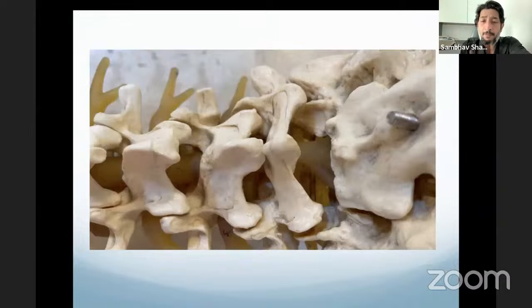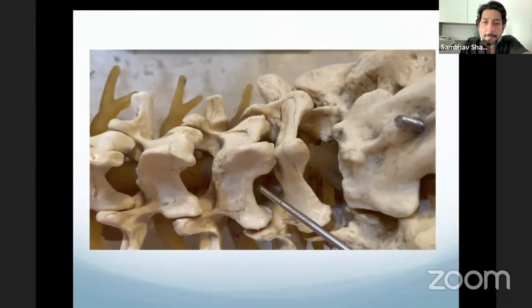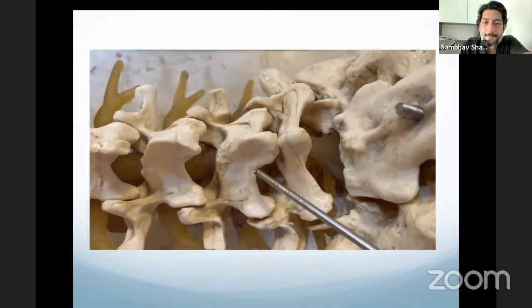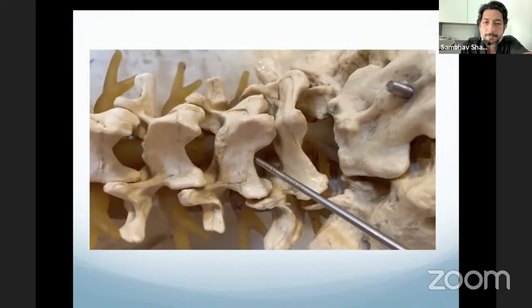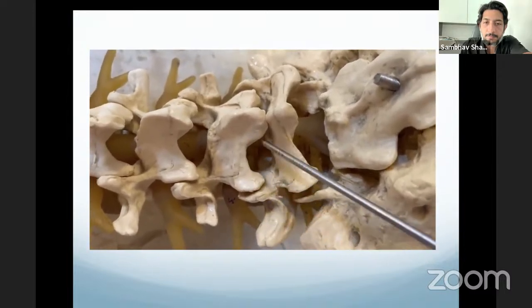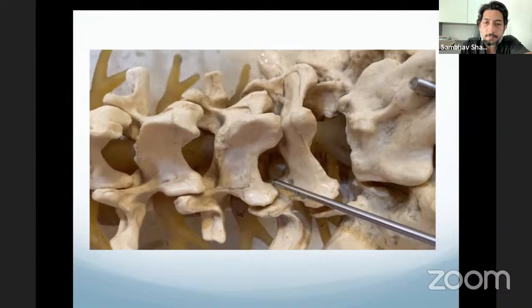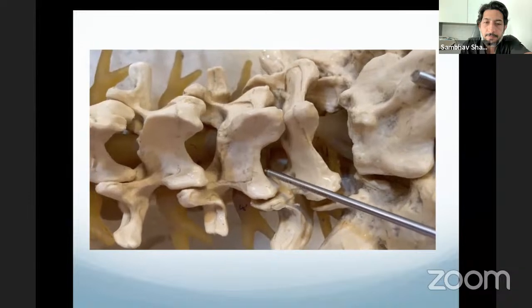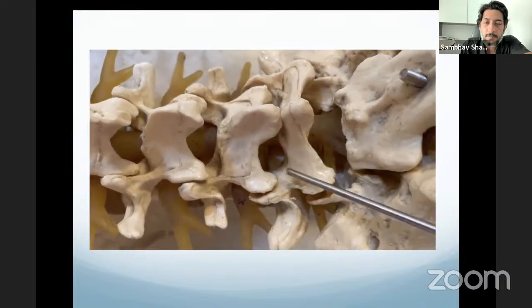So once we've put the scope, the surgery is like any surgery. So where we are feeling the lamina, if you dock over here, once you see through the camera, you should be able to appreciate the ridge of the lamina, the middle part of the facet, and medially the spinous process ridge. And here you will find the flavum. So all the soft tissue needs to be cleared. Once the soft tissue is cleared, you find the medial ridge of the medial facet, below which will be the superior facet. With the annular cutter or this forceps, we clear out some soft tissue from here, clear out soft tissue right from the lamina and the spinous process.